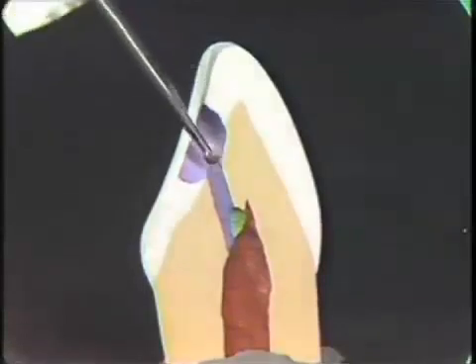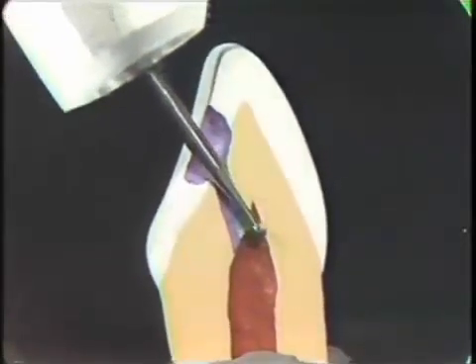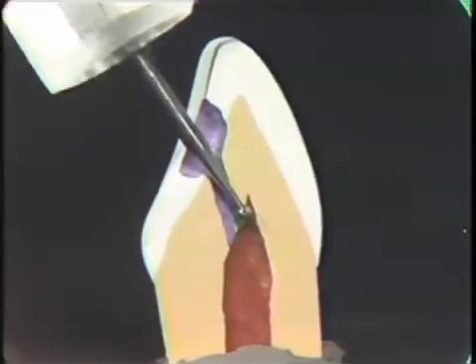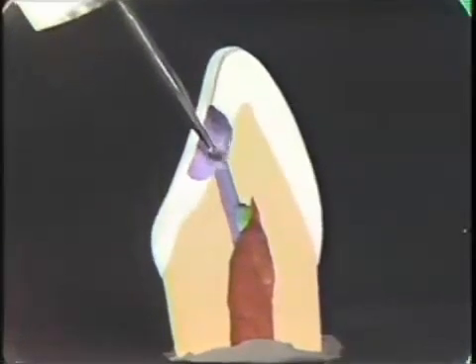Now let's return to the model. Okay, returning the burr into the pulp chamber, feeling for the wall, keeping away from the wall, recognizing where the roof of the pulp chamber starts, you slowly remove the pulp chamber, working from the inside out.